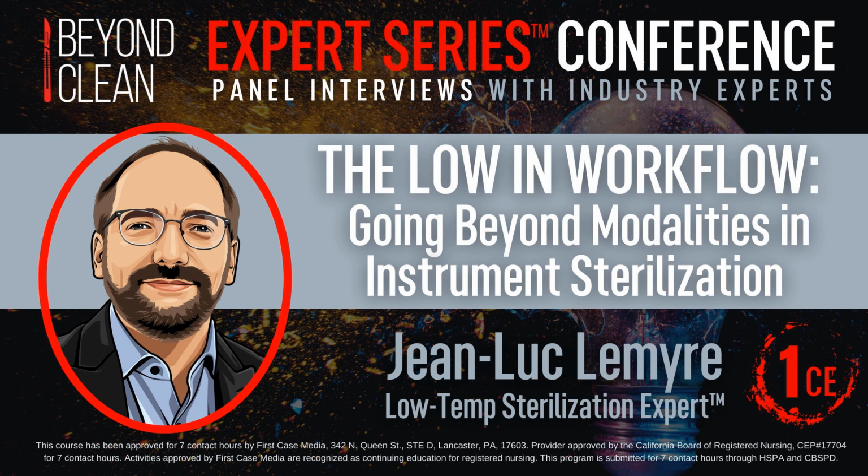So manufacturers of sterilizers have to test the biocompatibility of different materials and types of devices. And the last one would be the device functionality itself. These are designed to reprocess medical devices multiple times, and one of the considerations is to ensure that these devices stay functional for a long period of time to ensure user safety or patient safety. Yeah, I'm sure that's a big consideration in the manufacturing process.